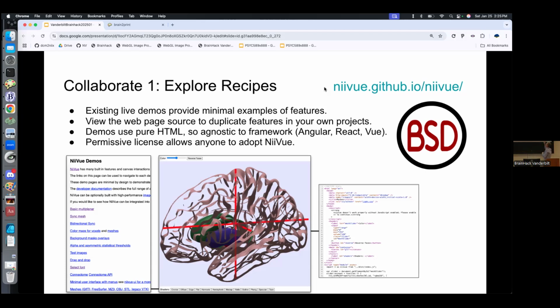So when I worked with FreeSurfer and FSL, I mean, the AFNI group is already open source, but I said, everything we do is BSD. And my analogy for this is O negative blood. We are the universal donor. If you have an institutional license, you can use it.